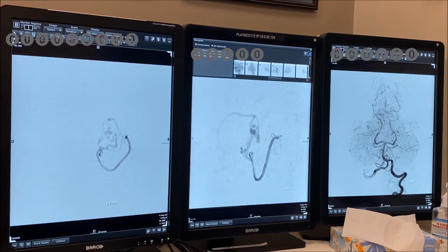Okay, and it does help. So you can see here the catheter is proximal here, right? Definitely this we cannot sacrifice. It shows this segment is normal, right? As we come in, there comes the bizarre. Indeed, there is this bubble. There's another little bubble there. There is a funny channel here, another channel with that. And then I pick up normal vessel up here. Okay? And I look at this vessel.